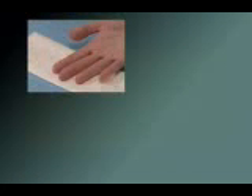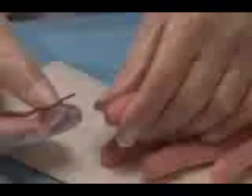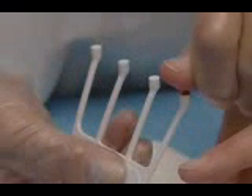A capillary blood sample can be taken from either a fingertip or an earlobe. Wipe the fingertip clean with the sterile wipe. Pierce the skin with the lancet. Using your thumb and forefinger, gently squeeze just above the puncture site and press out a drop of blood.